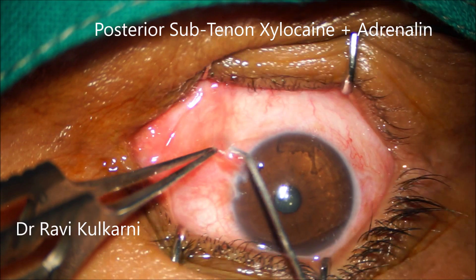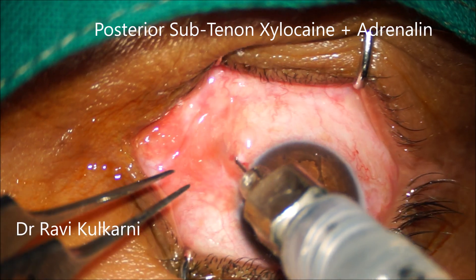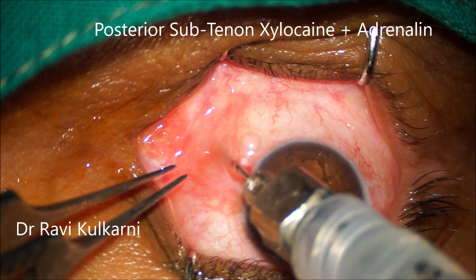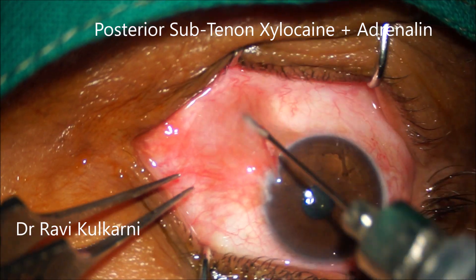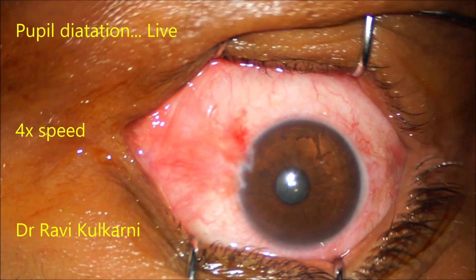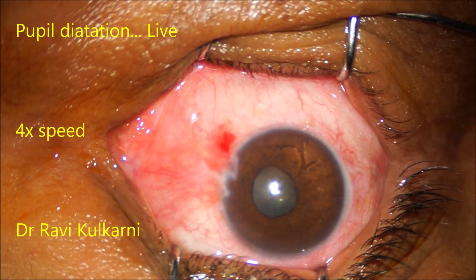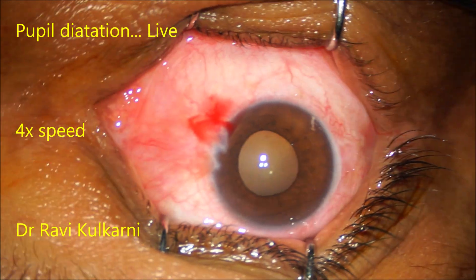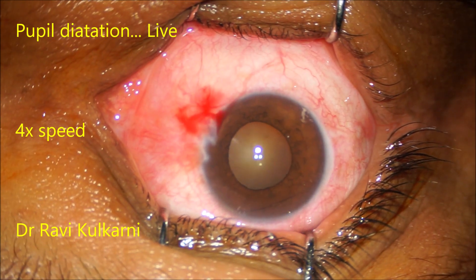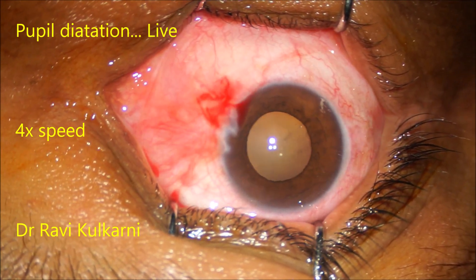Let us see pupil dilatation live. This is a posterior sub-Tenon's xylocaine with adrenaline. About 2 mL is injected in the posterior sub-Tenon's space. You can see the pupil starts dilating immediately. This is at 4x speed. The pupil dilates almost 70%.